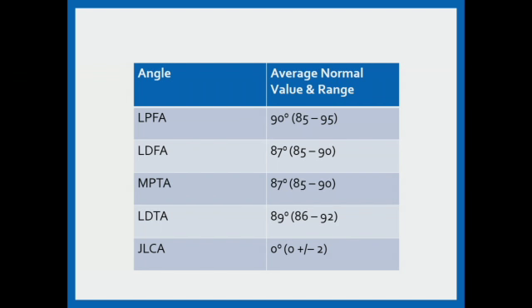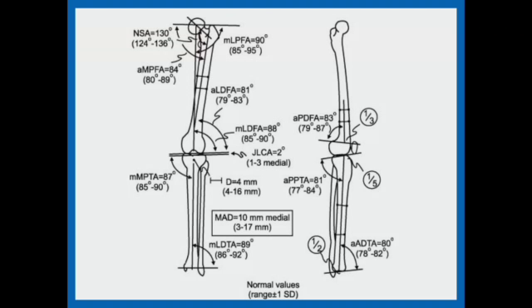And you also look at the joint line congruence angle, which is this here. So normally the joint lines should be parallel to each other. So the line through the distal femur should be parallel to the line through the proximal tibia. So if there's any deviation, which means that the genu varum or valgum is actually present in the knee itself. Say, for example, if there is somebody who's got medial compartment OA. So that is what the lines you look for.